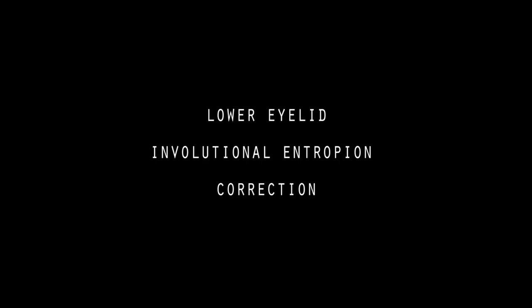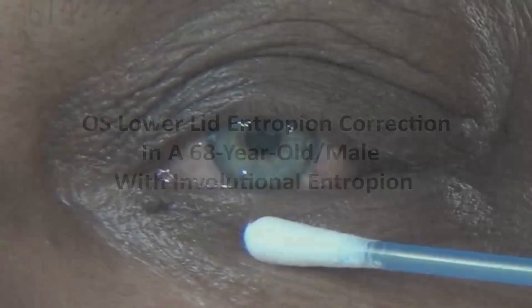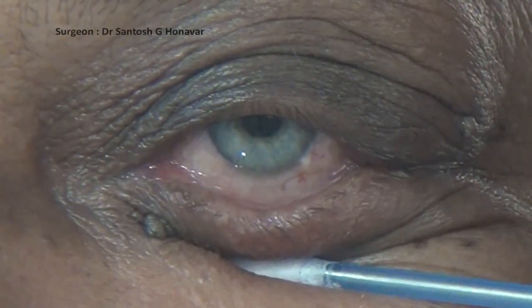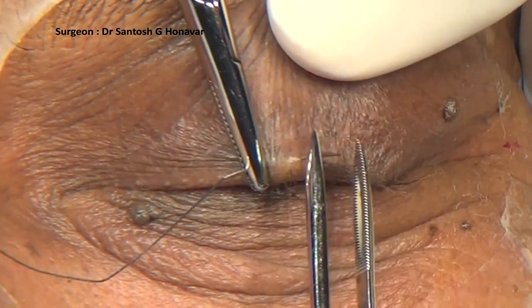This video illustrates lower eyelid involutional entropion correction by the Jones-Worbic procedure, performed under local anesthesia. Involutional lower eyelid entropion has three components: horizontal eyelid laxity, overriding of the preseptal over the pretarsal orbicularis muscle, and attenuation of the lower eyelid retractors.